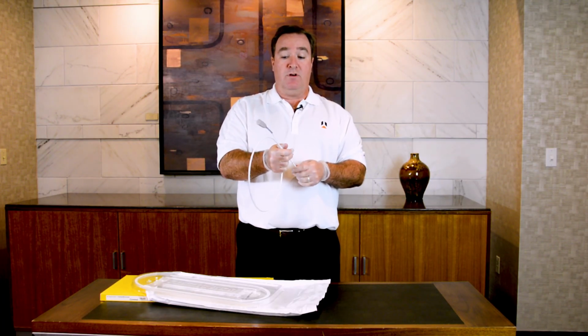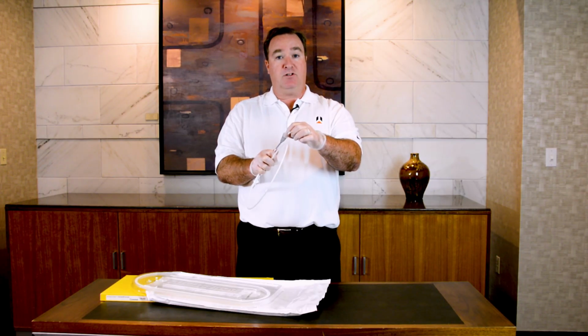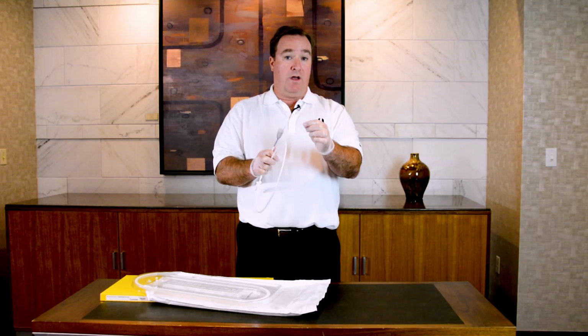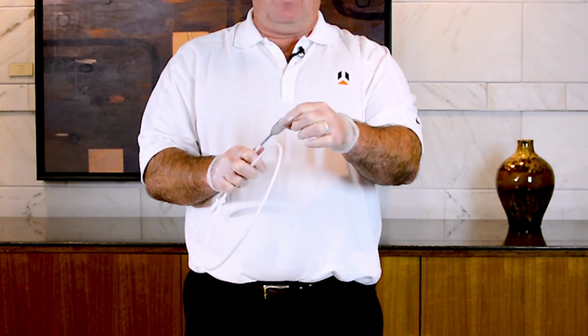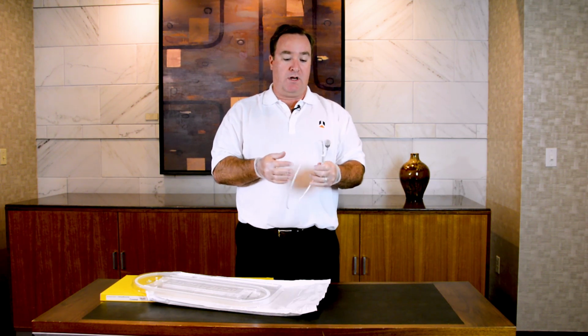If you do need to reposition the stent, you can grab the edge of the stent with either a rat tooth retrieval forceps or a biopsy forceps without a needle, and simply pull the stent back and up proximally into position where you'd like it.